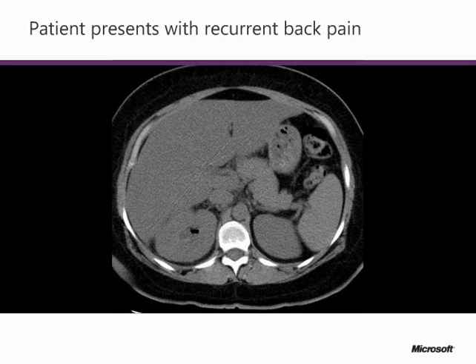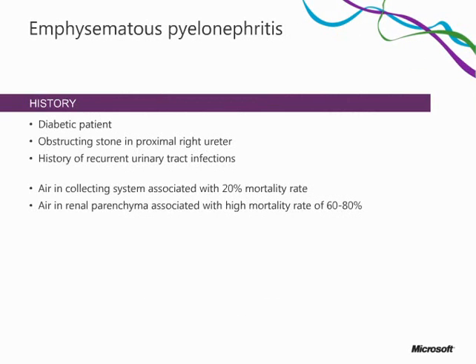And emphysematous pyelonephritis, if that were the diagnosis, and that's what it did turn out to be in that patient, has a mortality rate of as high as 20%, so it would be a true surgical emergency. So as a radiologist, is this a true surgical and medical emergency, or alternatively, is this just an expected normal finding associated with a previous procedure?